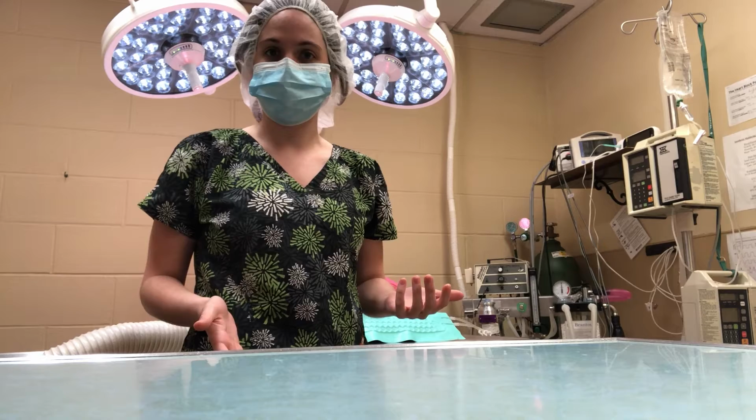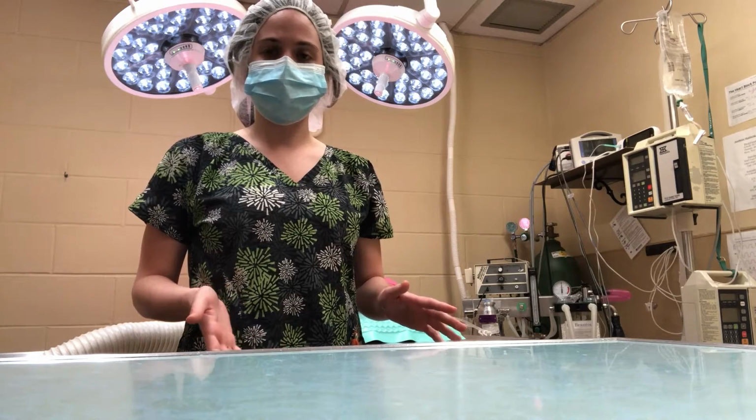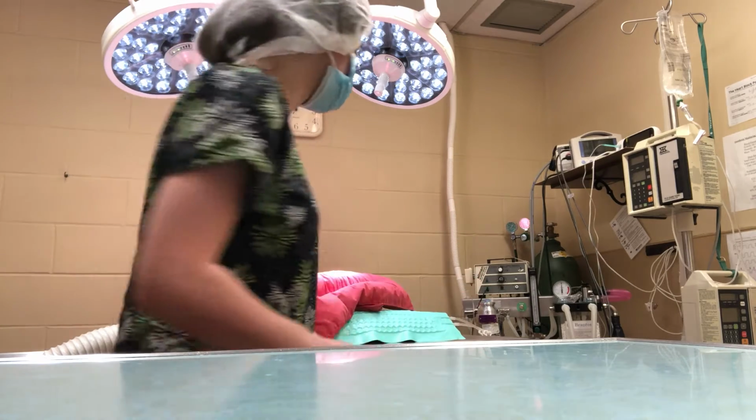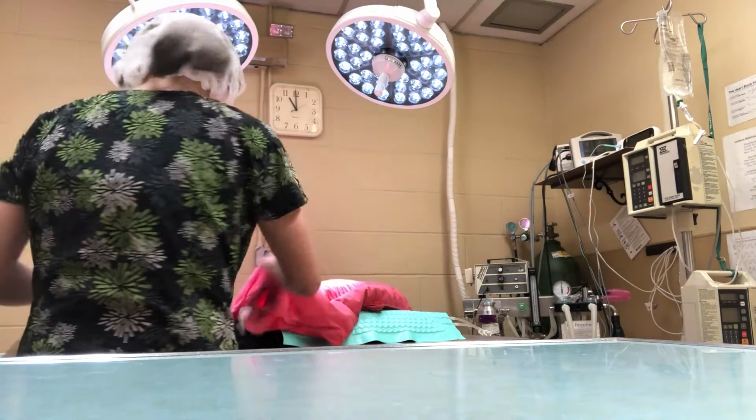At the end of every surgery, we have to make sure that everything is clean and ready to go for the next surgery. This happens to be the last surgery of the day, so we're going to go ahead and turn all the machines off and just clean all those surfaces. So first thing I'm going to do is shut off our Bair Hugger.